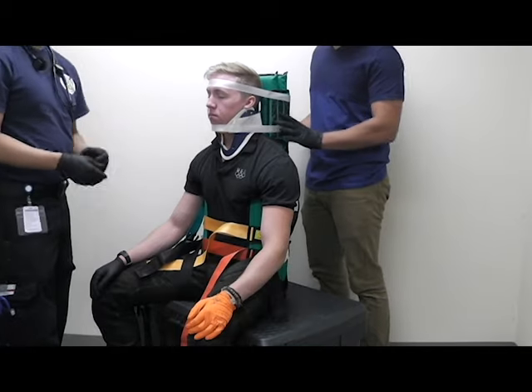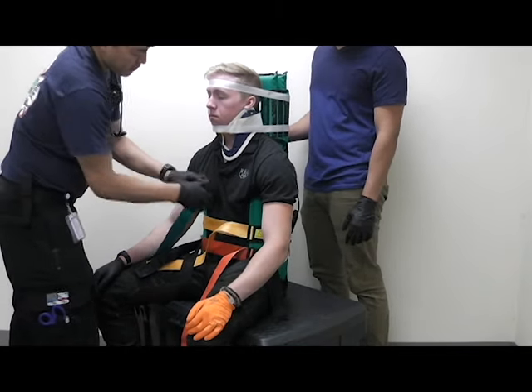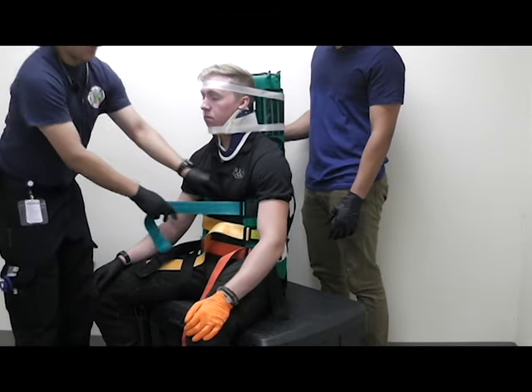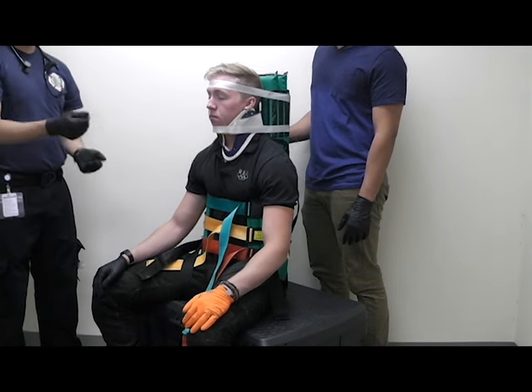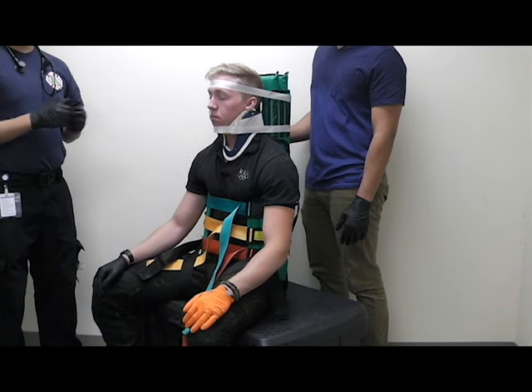I'm then going to finish with the top strap, which is the green strap here. Underneath and tighten. Now this can be used for removing a patient from a car in a seated position, and you move on to a backboard using as little motion as possible.